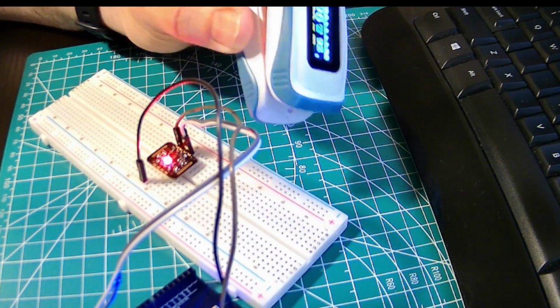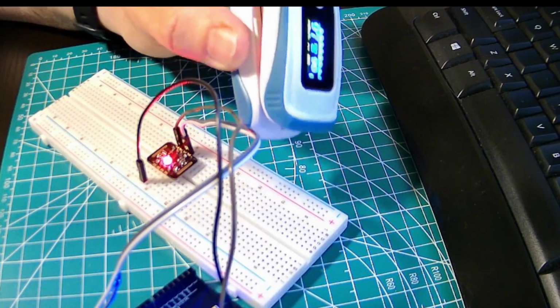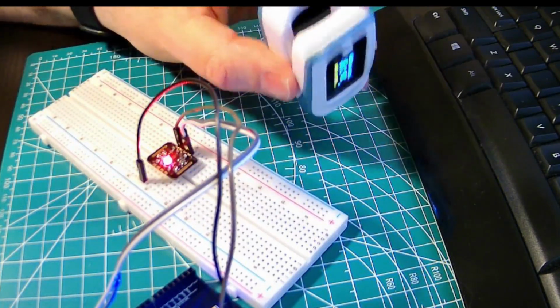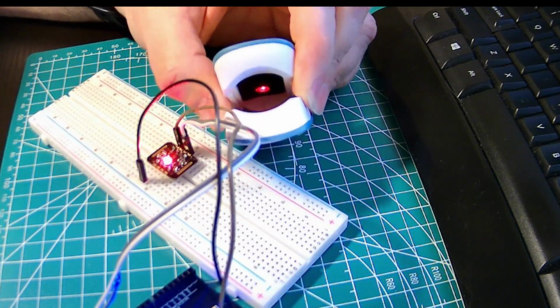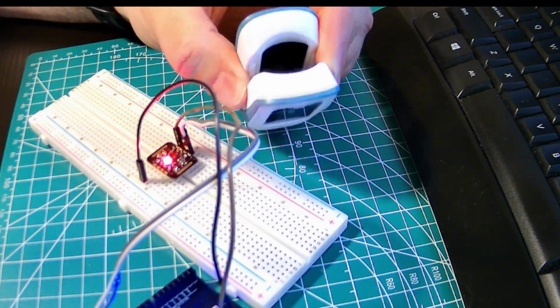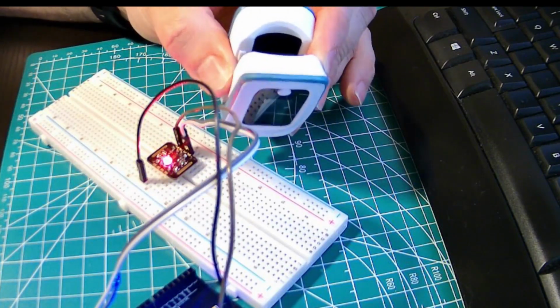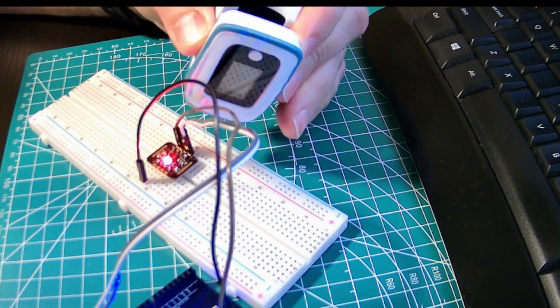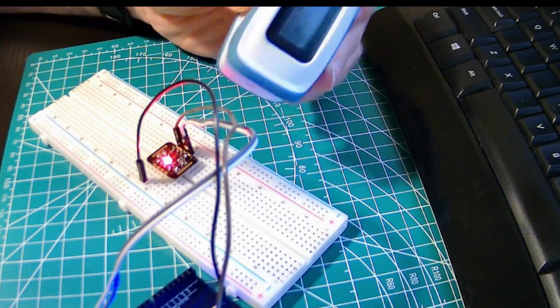Thus, with a combination of LEDs that transmit red and infrared light, along with a light sensor like a photodiode, we can measure blood oxygenation. So we place the LEDs and photodiode against the skin, arranged so that the photodiode can detect the light. Pulse oximetry can be done through a transmissive mechanism where the LEDs transmit light through a thin area of the body, like an earlobe or finger, to the photodiode on the other side. Alternatively, it can be done through a reflective mechanism where the LEDs and photodiode are on the same side of the skin surface, but the photodiode detects the reflected light. We'll be talking about the reflective method mostly now because that's how the MAX30102 sensor works, and even devices like I'm holding here.